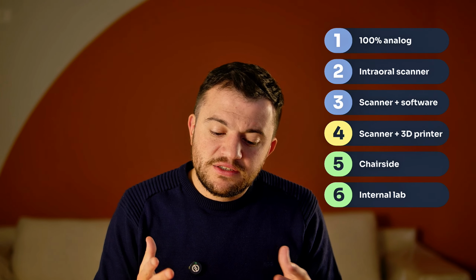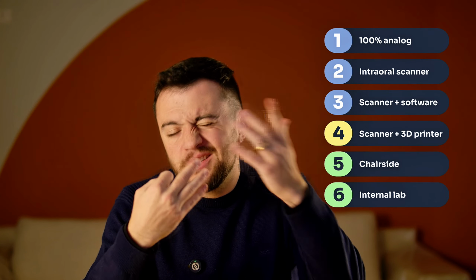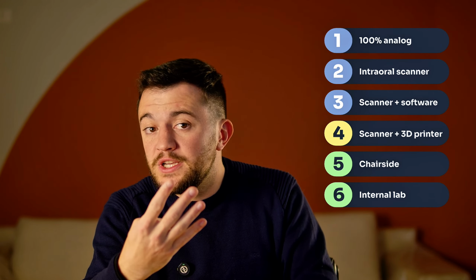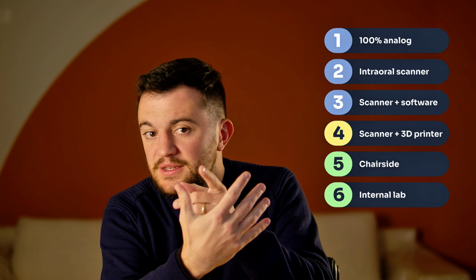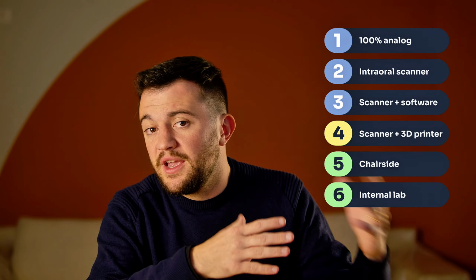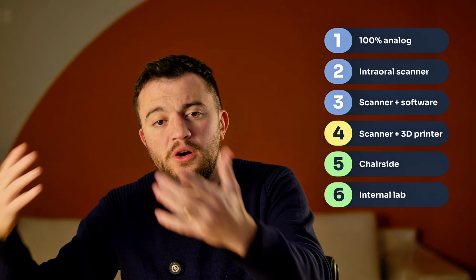So this summarizes the 6 levels. Level 1, fully analog. Level 2, just a scan. Level 3, scan and design, maybe a little bit of smile planning. Number 4, scan, design, print. Number 5, scan, design, and mill on a chairside workflow. And number 6 can do everything plus zirconia on bigger cases.